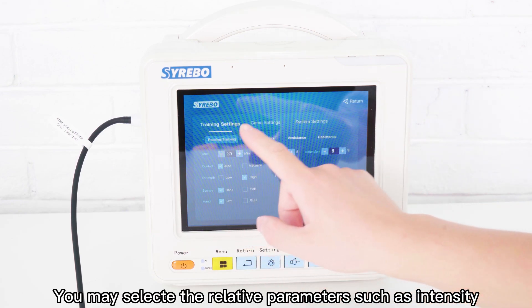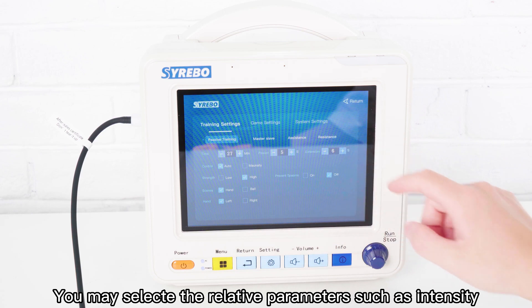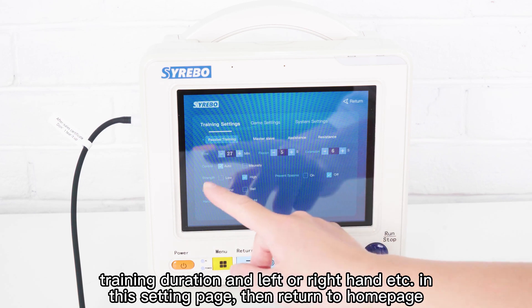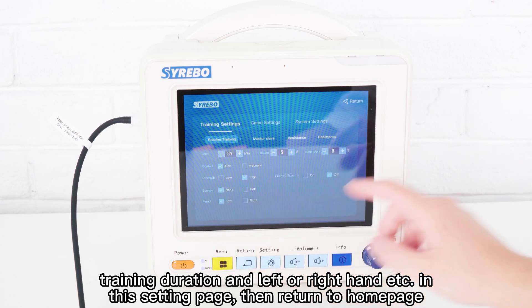You may select relative parameters such as intensity, training duration, and left or right hand in the setting page, then return to the home page.